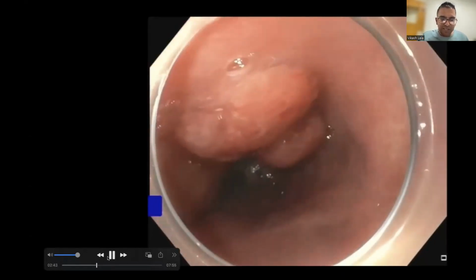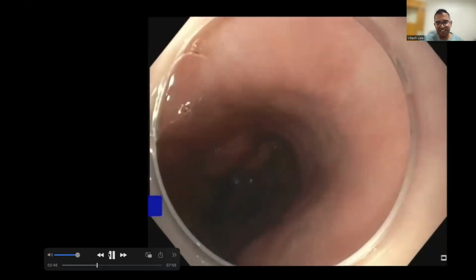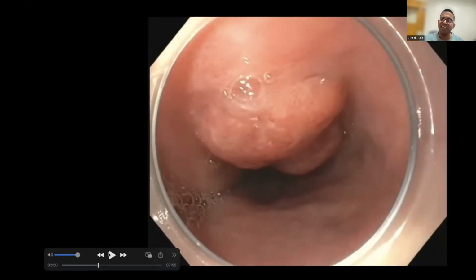Now, the one thing I want to highlight is when you find pathology, whether it's in the colon or whether it's in the upper GI, our first instinct is to switch off because we find the fungating tumor in the cecum and we say, fantastic, we found the cause of iron deficiency. We biopsy it, we switch off and we come out. But then we miss the synchronous cancer or we miss the dysplastic polyp on the other side that also needs to come out. And when you find one lesion, that's a harbinger that there's going to be others.